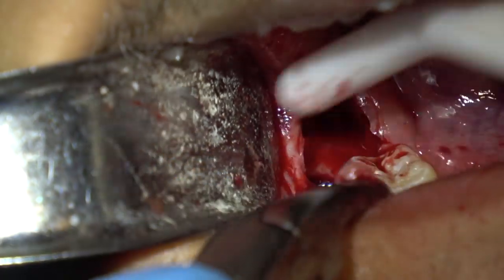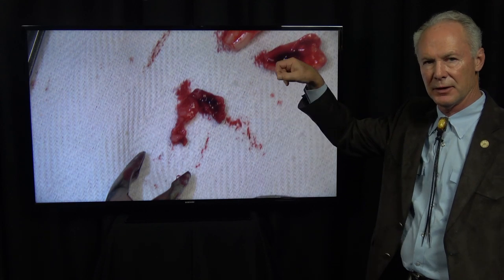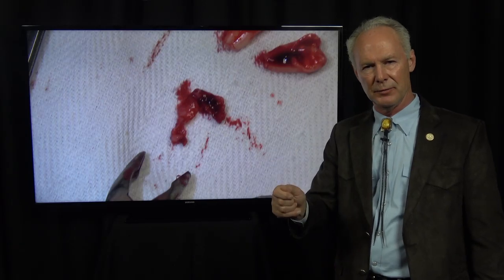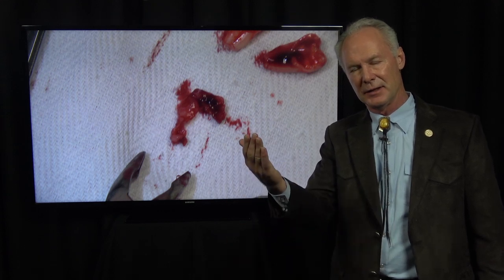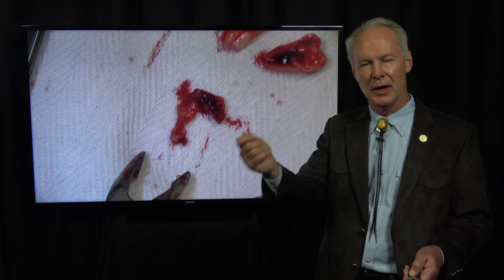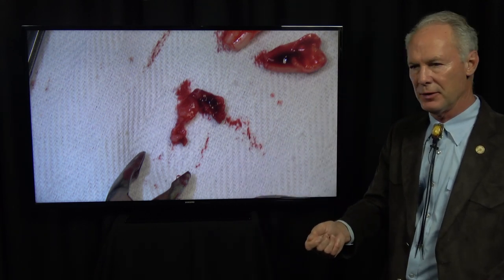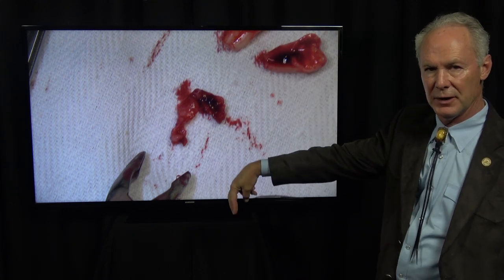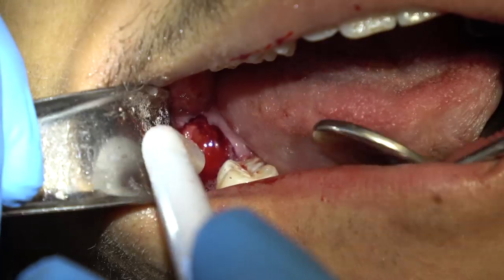Now I'm removing the follicular sac from the socket, and that's very important — you do that with rongiers. If you don't, it could develop into a dentigerous cyst and an ameloblastoma. So be sure to remove that follicular sac. You don't want to curette it with a spoon because there's a nerve at the apex of that extracted tooth — you don't want to damage the nerve. But do go back behind the second molar with those rongiers and remove the remaining follicular sac.